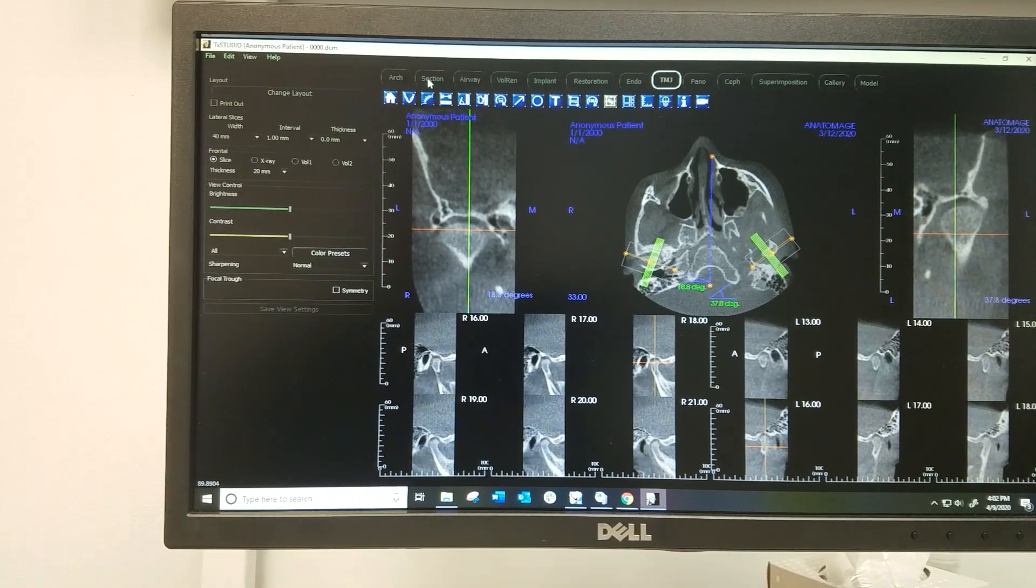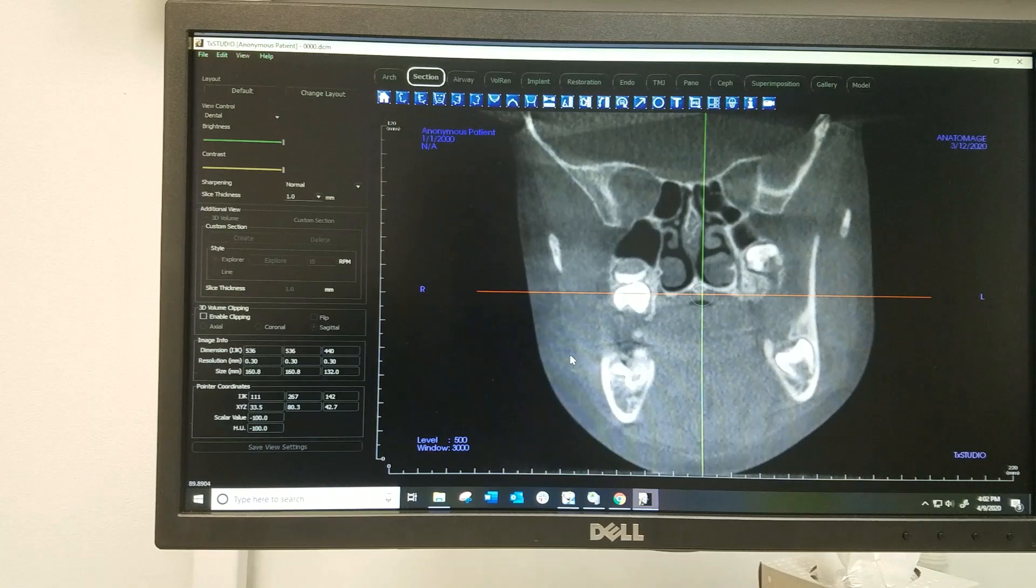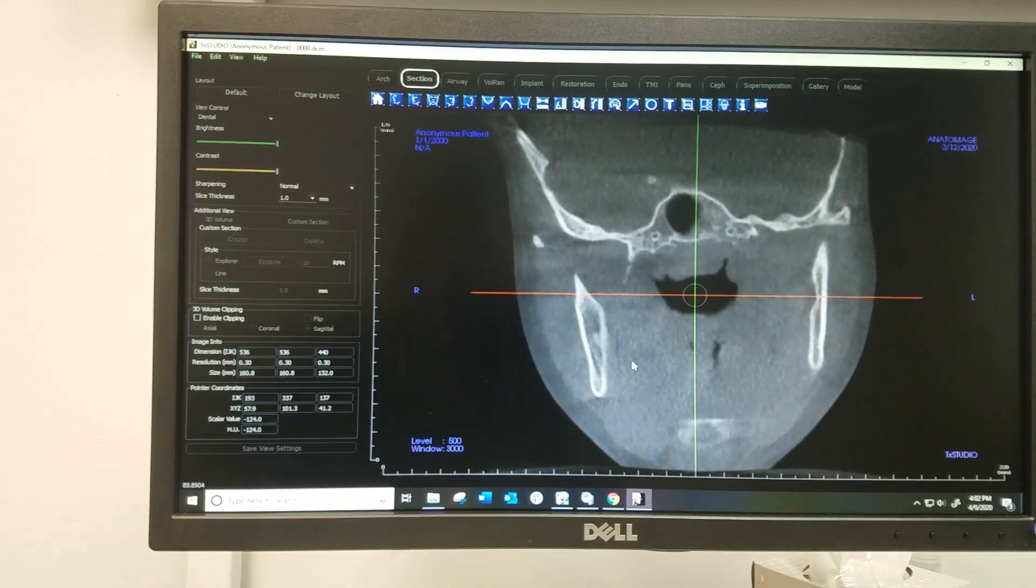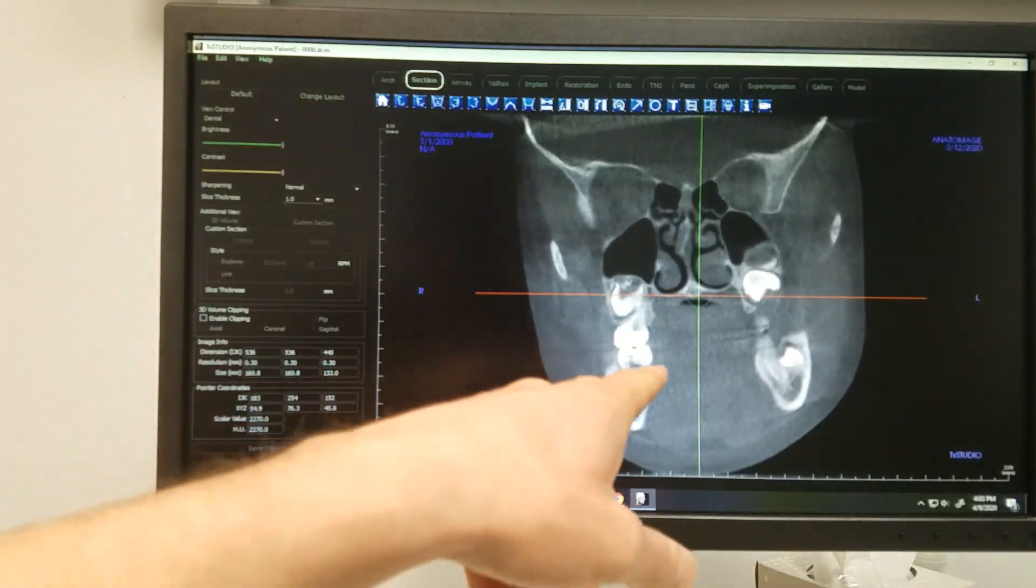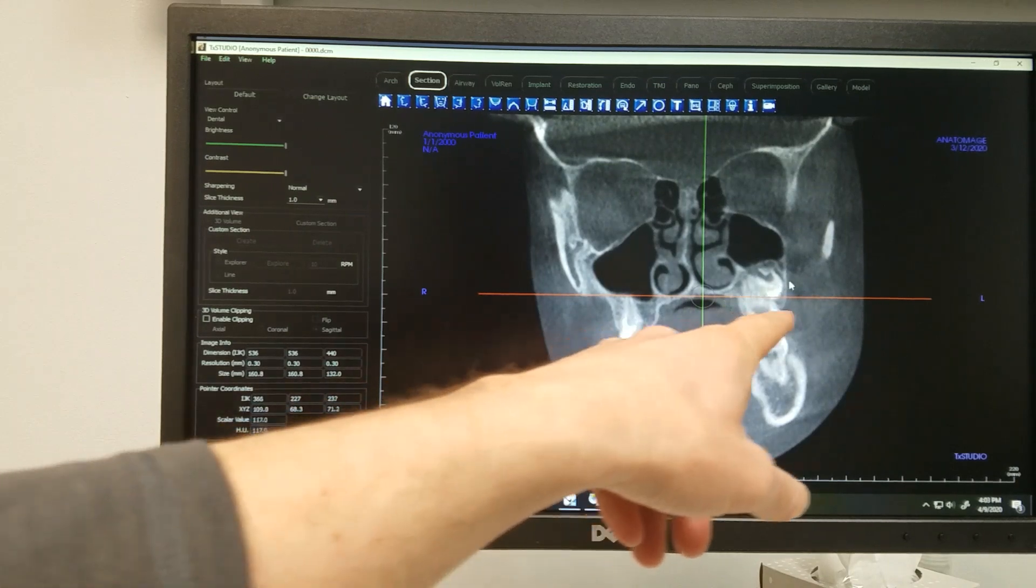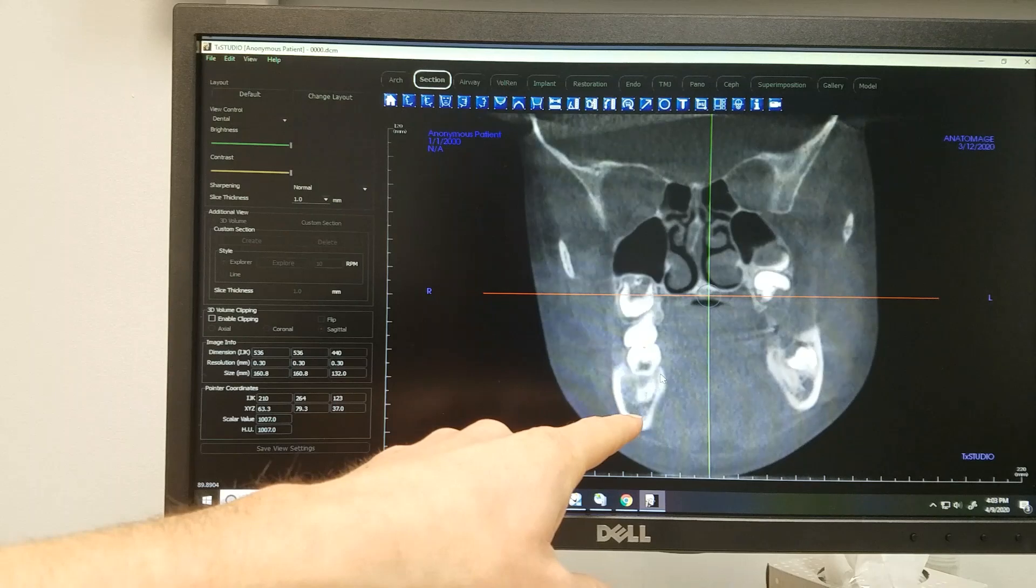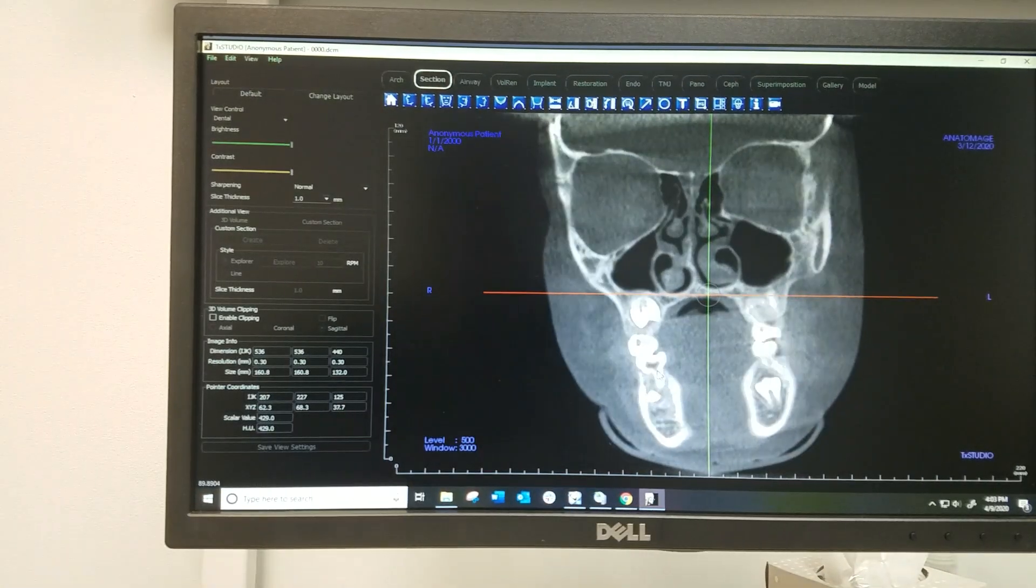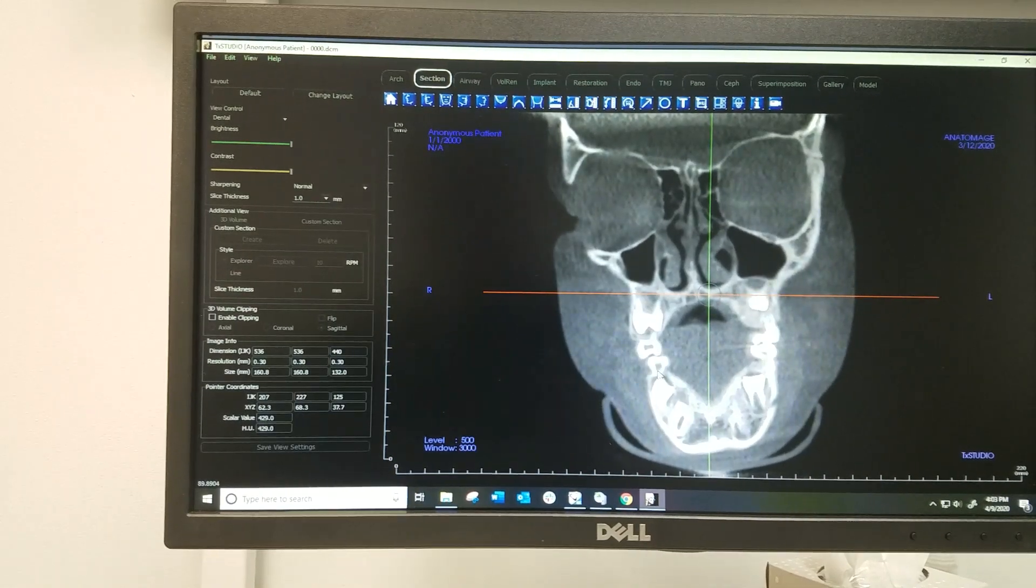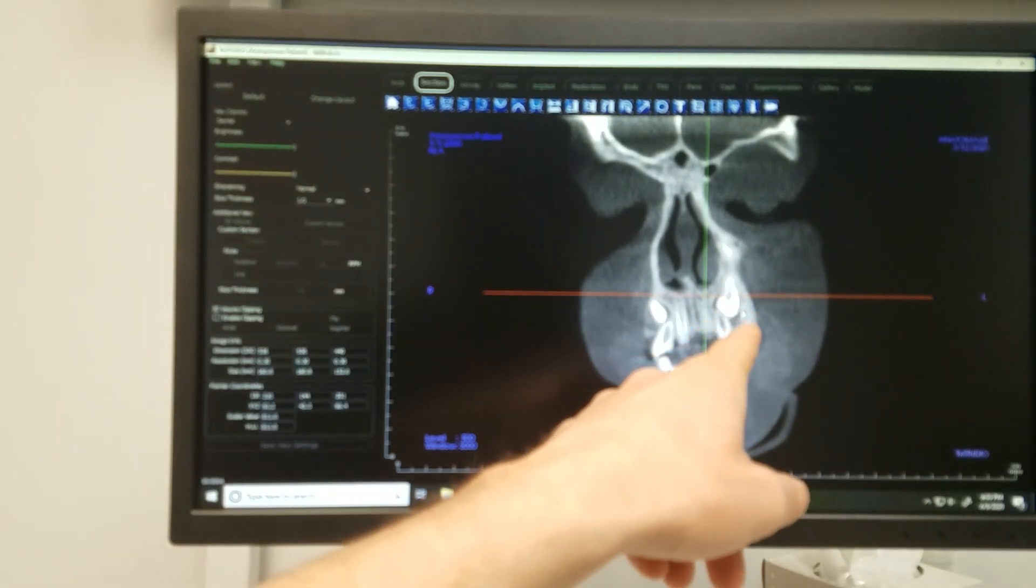I'm just kind of showing you how cool this is. I won't get into too many more details, but again, this is the one I really like here too - we can see the cross-sections. We can scroll through from front to back. As we see the teeth come up here, these are the molars, we can determine is the width of this bone wider than the width of this bone. A lot of times that's what we want to see when we're trying to decide if expansion is needed, because the teeth can tip in and tip out. So just because there's not a crossbite doesn't mean that expansion isn't needed.